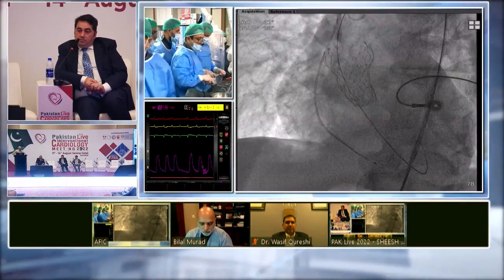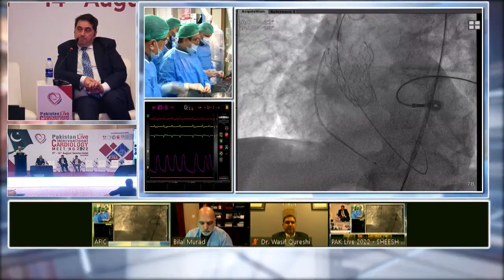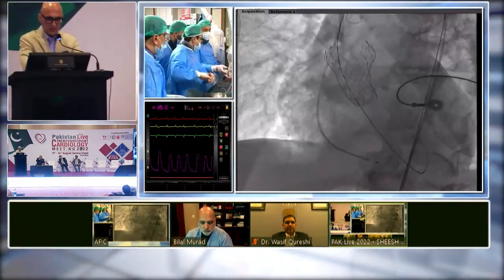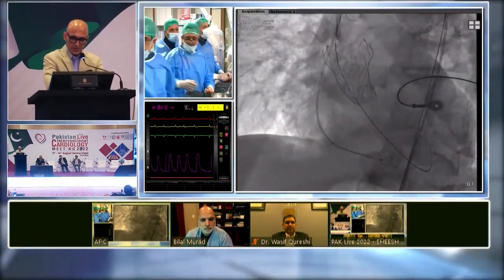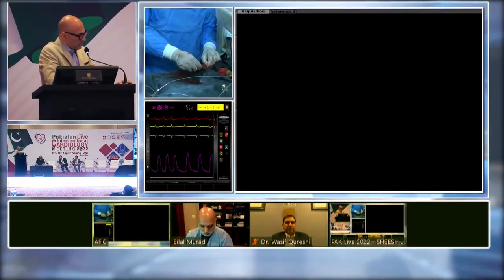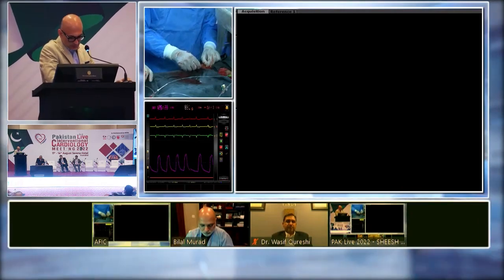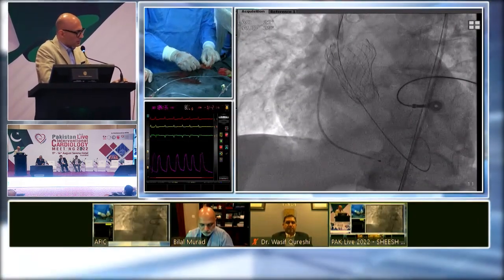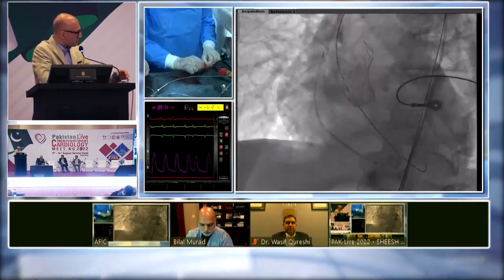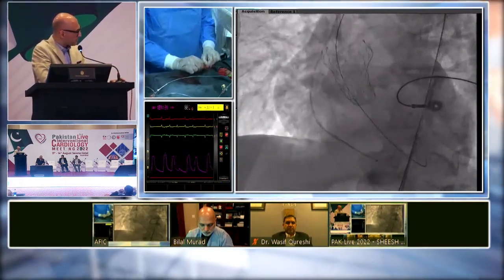26 balloon, please. We see the pressures coming up nicely, diastolic a bit low, rhythm was unpaced. Initial impression was that there was a ton of calcium. What are you anticipating when you put in a self-expanding valve with this degree of calcium?